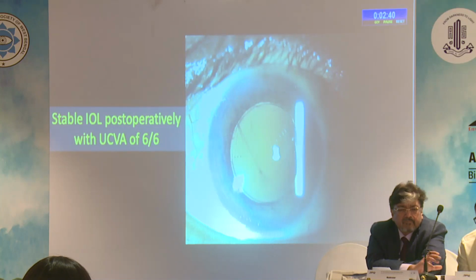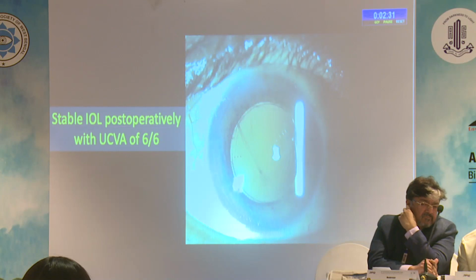All cases had an uncorrected visual acuity of 6/6 on post-operative day 1 with a well-centered IOL which maintained stability subsequently.